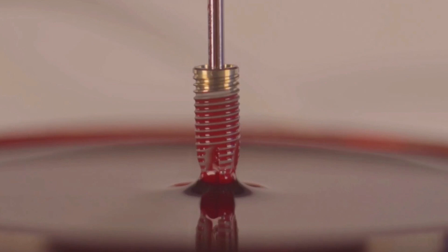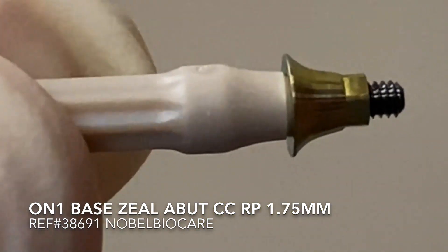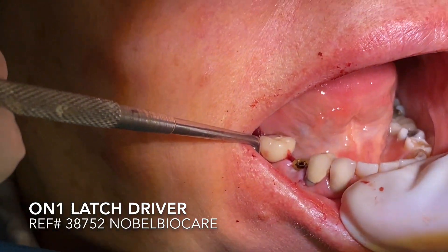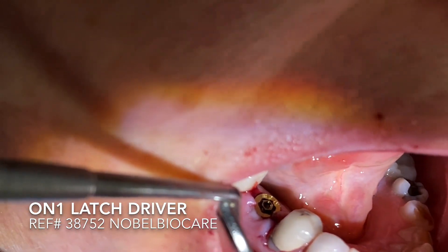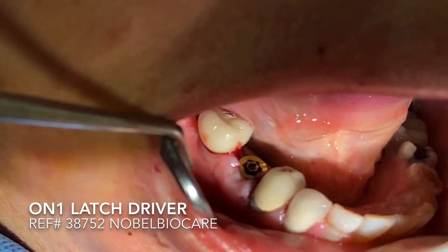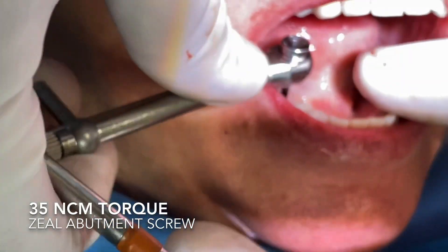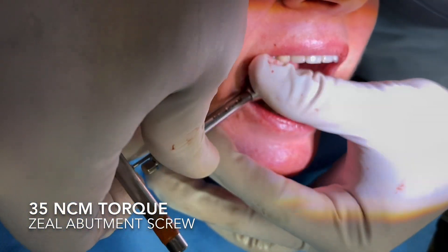This is the zeal abutment that I used — it's a 1.75, the one I like to use; I don't use the larger one. I'll use the latch driver, which has a black ring around it. When you go over top of the abutment, you're actually replacing it with a little plastic driver, but you'll come back and use the latch driver to make sure the abutment is in place. The wonderful thing about this abutment is that when you place it, it's securing the connective tissue around the platform shift of the implant. This is critical for long-term success because we want that area sealed at the time of surgery — it's a sterile abutment going on a sterile implant, and you never go back down to this area unless you have a problem or need to change the abutment.